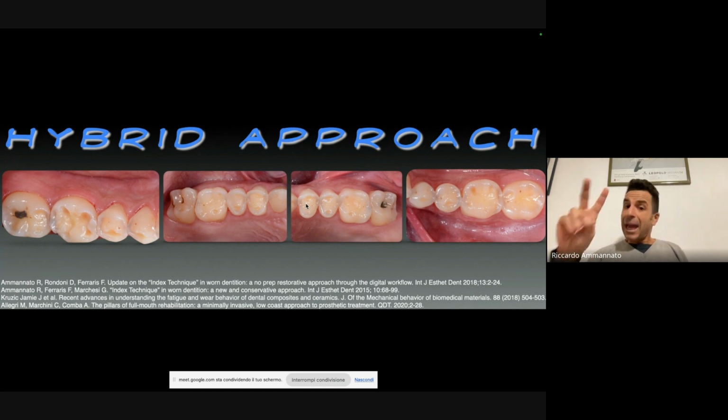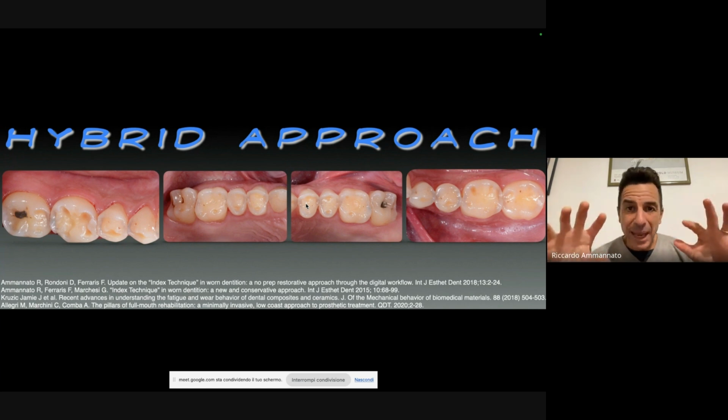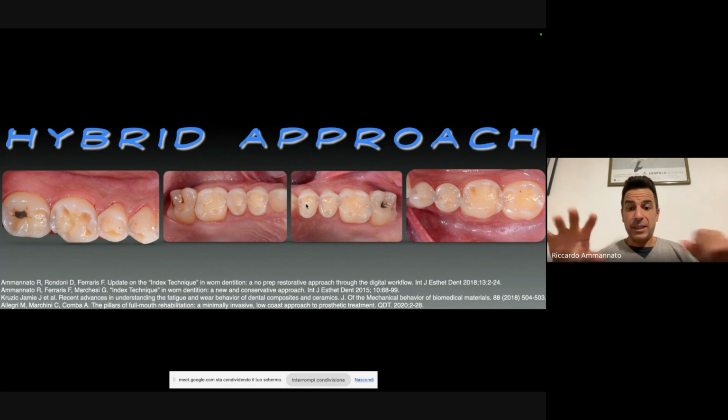So hybrid, because on the first upper and lower molars and on the upper and lower canines, I will cement glass ceramic onlays, Emax restorations. This is because the first molars and the canines are strategic teeth to manage static occlusion and dynamic occlusion.